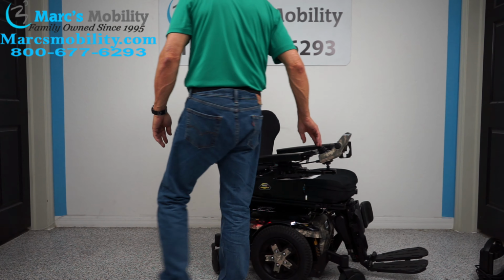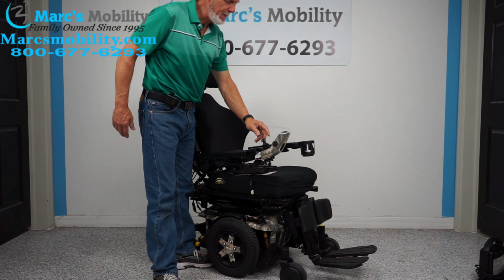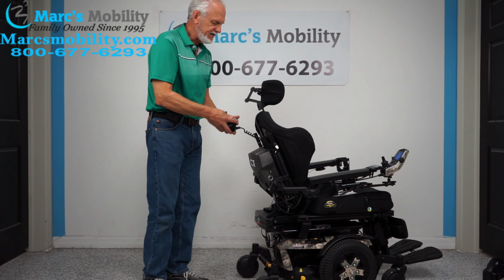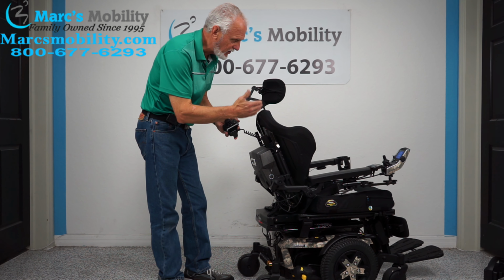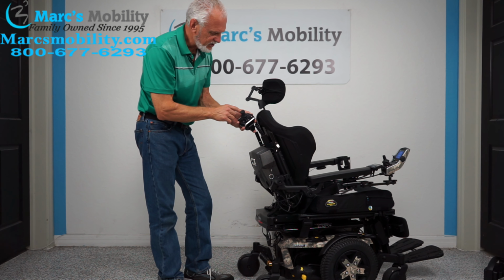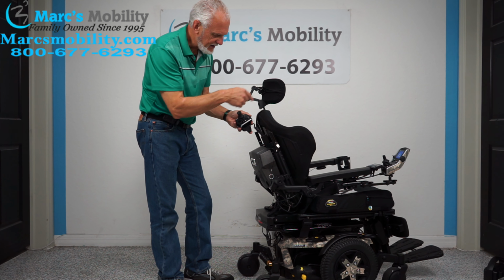And the button, again, for the light is right over here. Turn them off. On the back of this chair, we've got what's called an Attendant Control right here. I can drive this chair from back here. So if you have a person who cannot drive the chair themselves, switch the power to here. See, it turned off there, now it's over here.